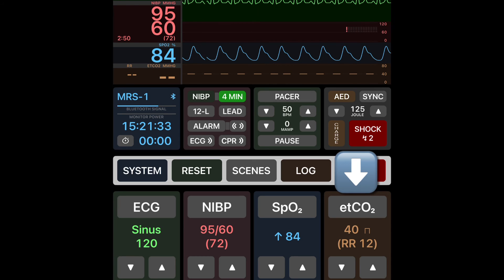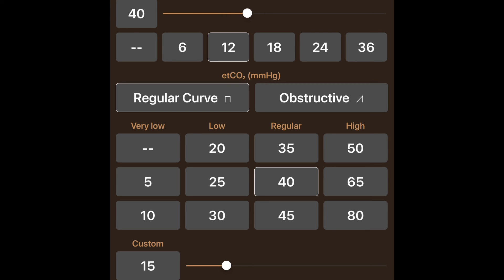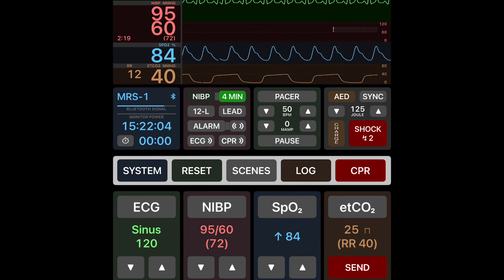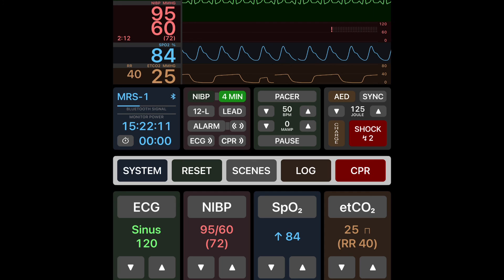Finally let's look at end-tidal CO2. In this section at the top you can adjust the respiratory rate as well as the curve setting and waveform. Let's adjust our respiratory rate and set our end-tidal to 25, then take a look at the main screen. Once we send this, we'll see our waveform change from the current settings to our new settings.